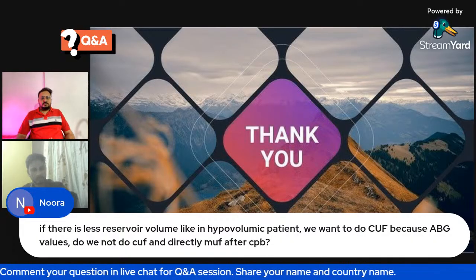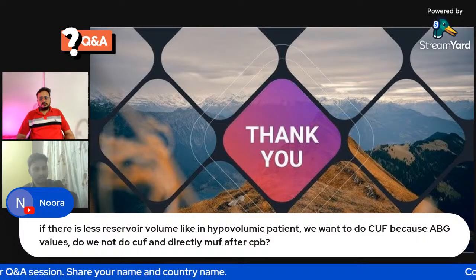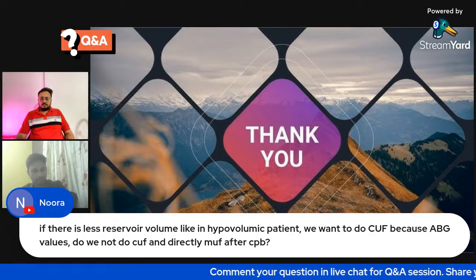Okay. And MUF depends upon the patient's arterial blood pressure actually. The reservoir volume does not affect MUF directly.